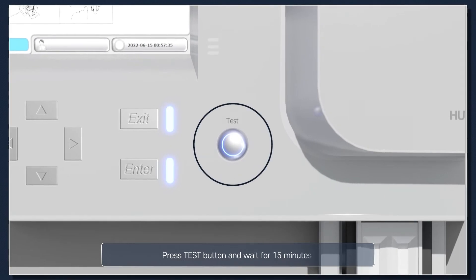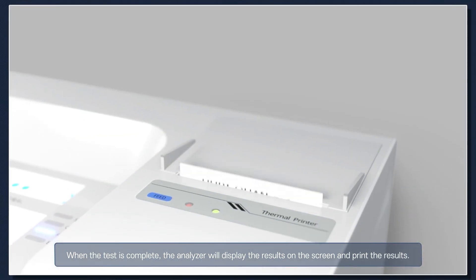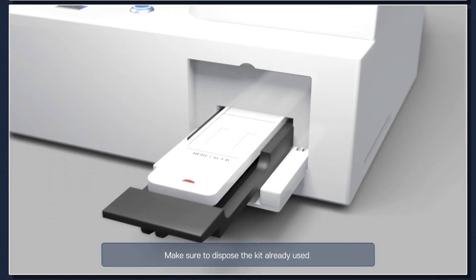Obtain the specimen using a suitable micropipette and drop 200 microliters of the specimen into the sample well. Press the Test button and wait for 15 minutes. When the test is complete, the analyzer will display the results on the screen and print the results. Make sure to dispose of the used kit.